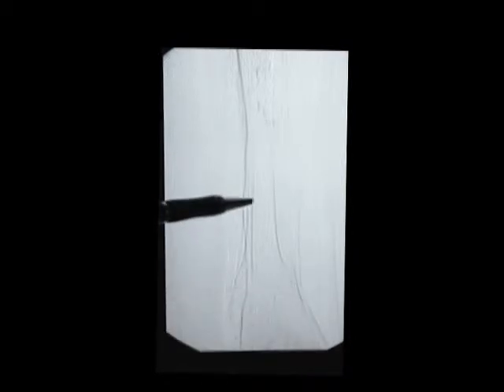Here we can see the continuation of the anterior tibial artery onto the foot. However, it is of diminutive size passing the ankle. The peroneal and the posterior tibial are never seen to reconstitute. This patient had tissue loss at the great toe and medial aspect of the foot. The anterior tibial and dorsalis pedis provided no benefit to these areas.